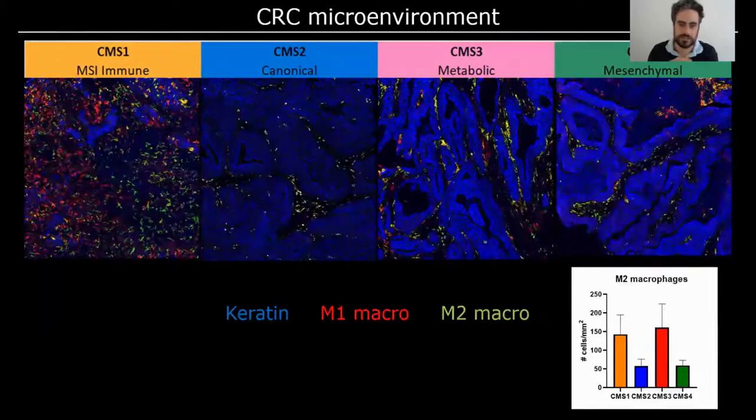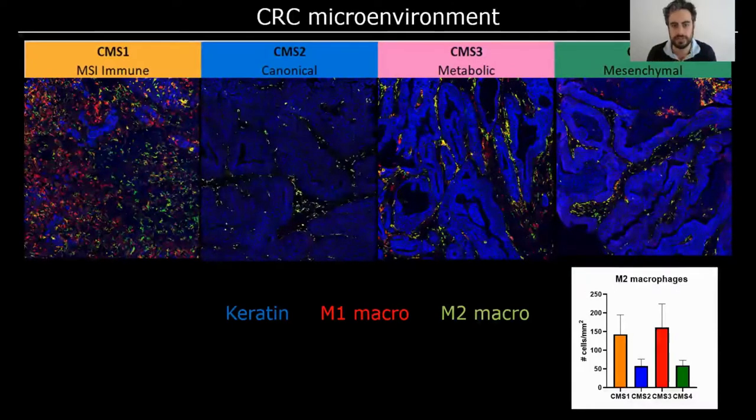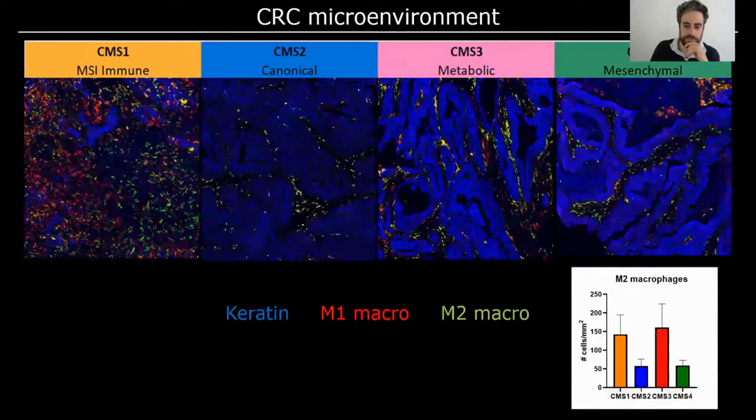And one of the coolest things of this technology, in my opinion, is our ability to distinguish tumor-associated myeloid subsets, namely different flavors of macrophages, monocytes, dendritic cells, which I think is quite challenging to do with other technologies, namely single-cell technologies. We know that these subsets are really complex, and it's very nice to see in the images all these different shades of myeloid cells, which have not always been captured with previous approaches.